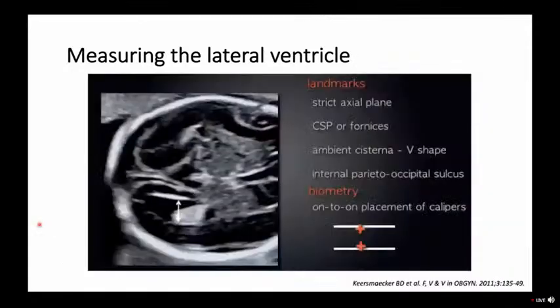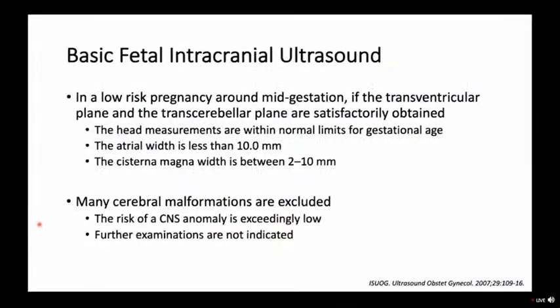The question is, why do I spend the time on this lateral ventricle? We'll talk about that next, because measuring the lateral ventricle can cause a lot of angst in the patient. This measurement should be under 10 millimeters. If it's not, basically you're telling them that maybe their baby's going to develop hydrocephalus. Then the MFM has to go in the room and talk to them about how there may be brain damage as this progresses. The baby may not have as high of an IQ. And so this particular measurement we want done correctly. Should be under 10, just like the cisterna magna.